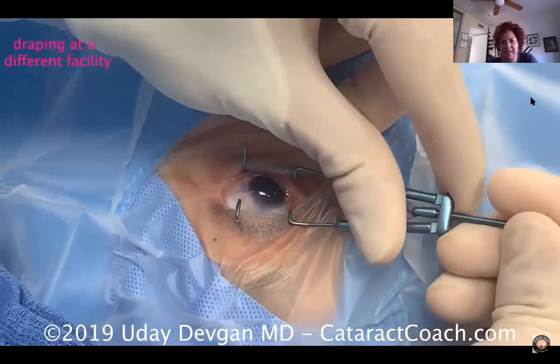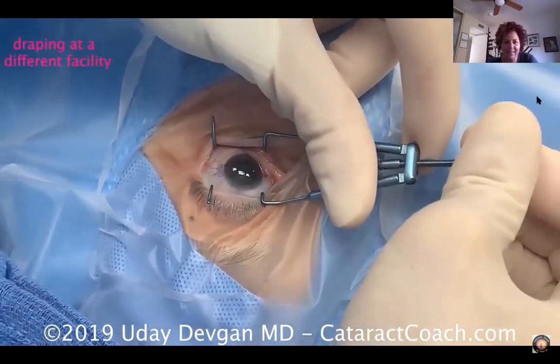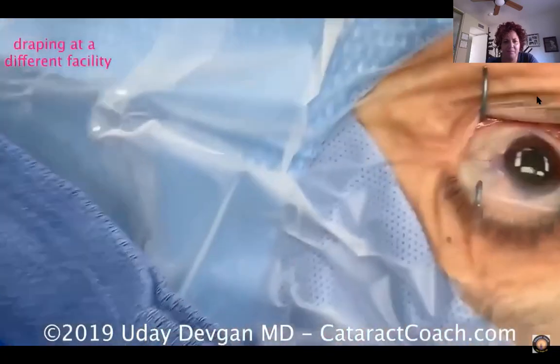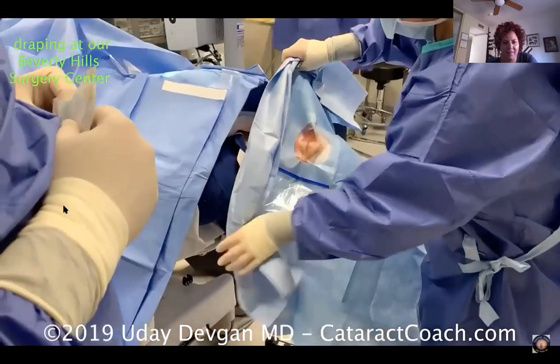So we'll zoom in here. He's adjusting the speculum, and that looks great. Good exposure. Again, completely isolating the eyelash margin. I think that's the key for our surgeries. Avoids the contamination by oil and or debris. Let's go back to Beverly Hills.